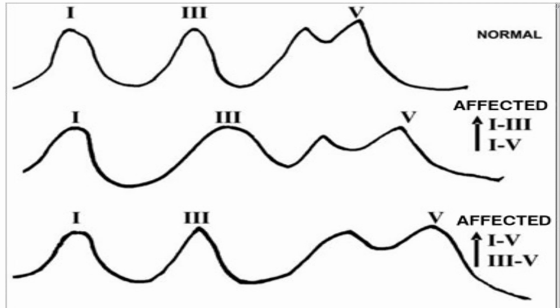So coming to another graph of BERA. Here there are three waveforms of BERA plotted. The first one on the topmost is normal BERA, and the second and third ones are abnormal. Why is it abnormal? We will see. Here we can see there are three different waves in this waveform, that is, wave 1, 3 and 5 are only visible.